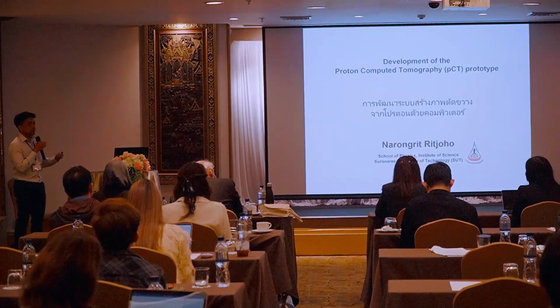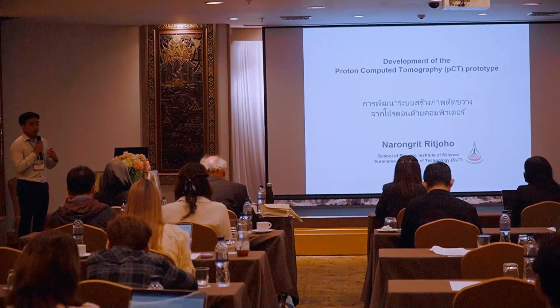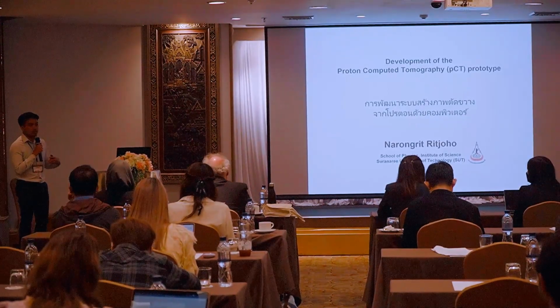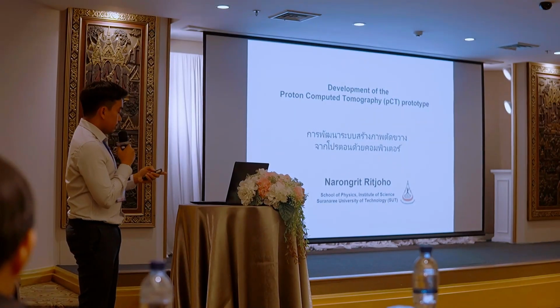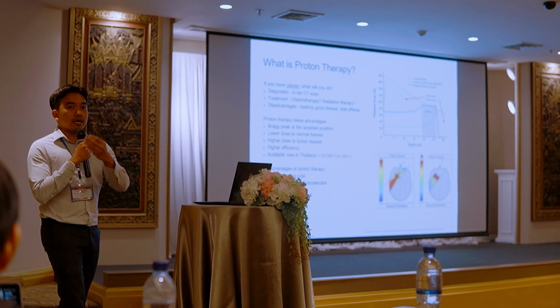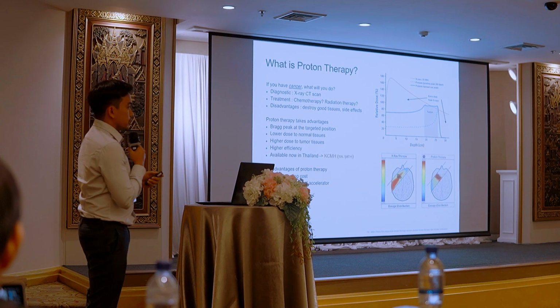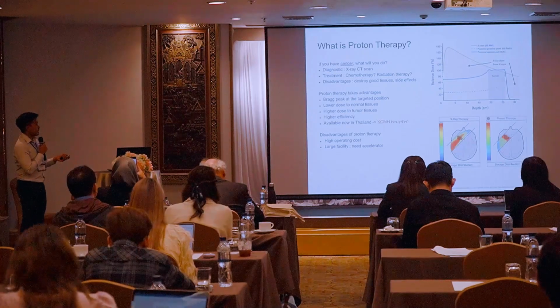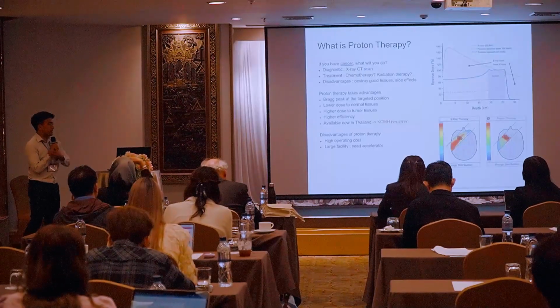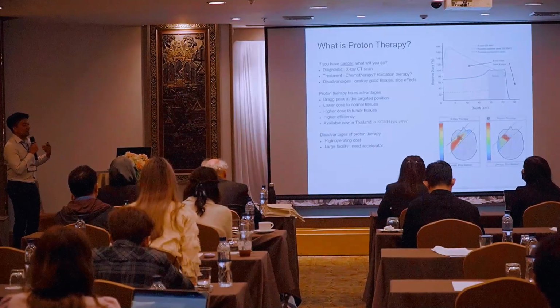First of all, I will tell you what PCT is. PCT is another type of medical imaging instead of X-ray CT. There are some benefits of PCT over the X-ray CT scan. As you have already learned from Martin and Dr. Chakapong in the first two talks, this is proton therapy. Today you heard from the developer of the accelerator and the doctor, and today I talk about the user. I mean, based on my experience.